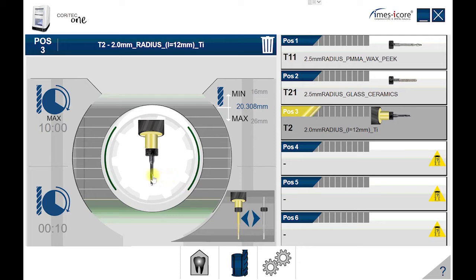This can be used to measure the tool after you finish registering the tool. In the center, you will see a visual representation of the tool in the collet. This area is also a button. You can see a cogwheel circling the image as well.